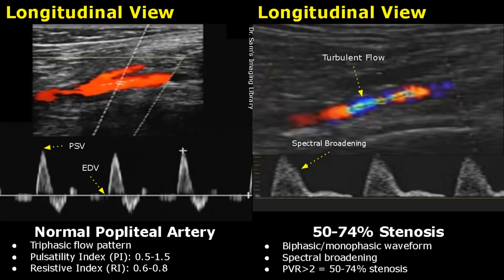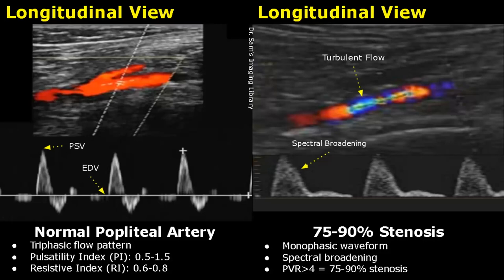In 50 to 74 percent stenosis, a biphasic or monophasic waveform is seen along with spectral broadening, and the peak velocity ratio is more than 2. In stenosis between 75 to 90 percent, a monophasic waveform will be seen, spectral broadening will also be seen, and the peak velocity ratio will be more than 4.